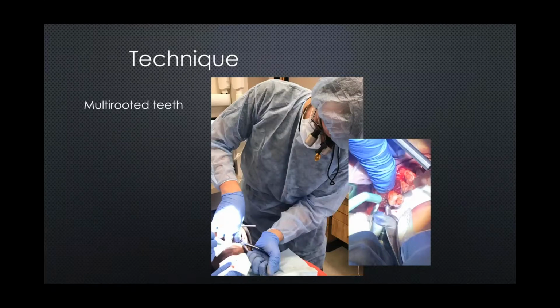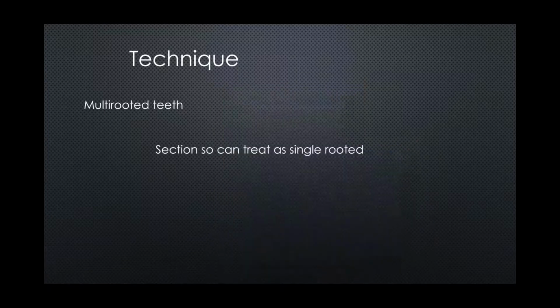So once again, pinch the alveolus, seat the forceps. It's going to be rotate, but pushing apically. You're severing the periodontal ligament tissues, and then gently it's a traction and pull the tooth out. Okay, that's your maxillary extractions. Okay, multi-rooted teeth. Of course, the old adage is let's divide and conquer. So if we try to take out a tooth that's shaped like an anchor, a maxillary first molar, it's going to be a nightmare trying to get that tooth out.